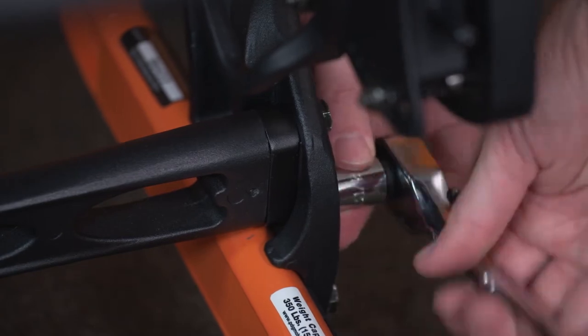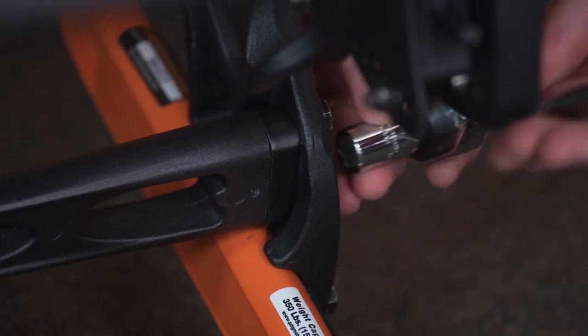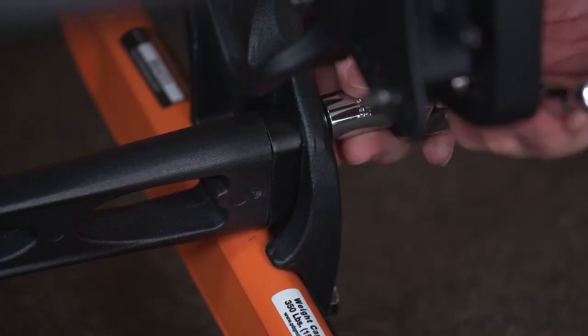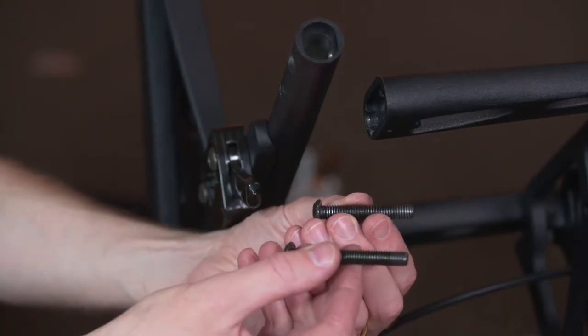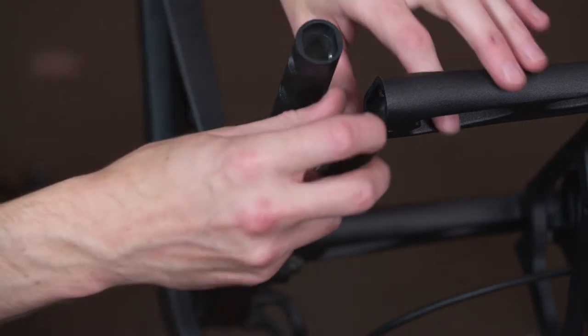Loosely tighten the fasteners to prevent excessive movement of the chair while assembling the upper frame. Repeat the process of fitting the spacer and replacing the fasteners for the upper frame front crossbar.